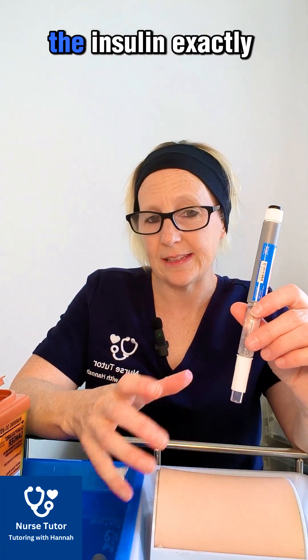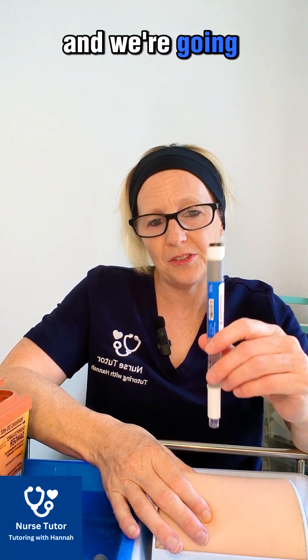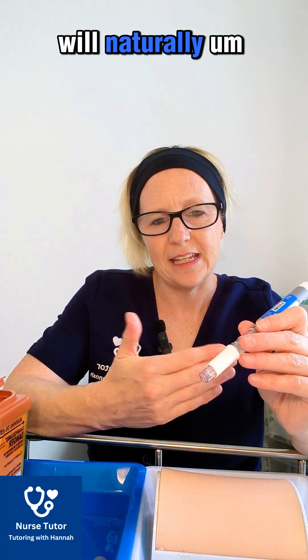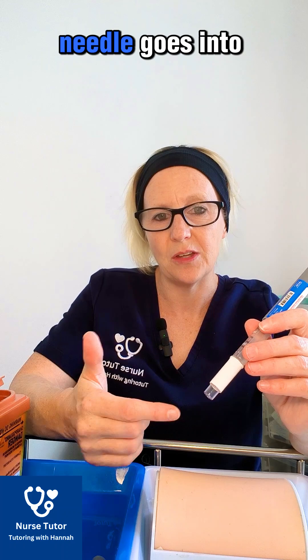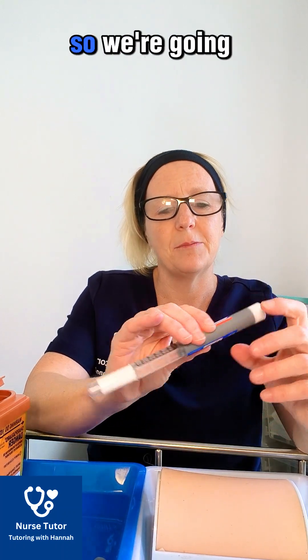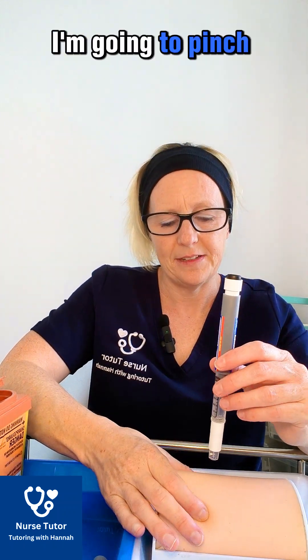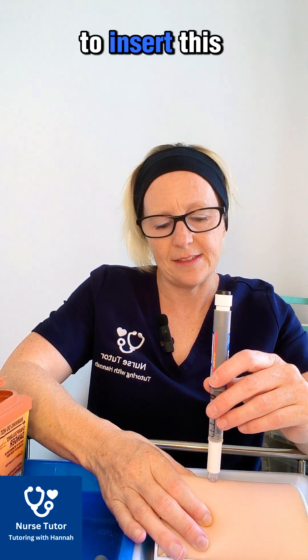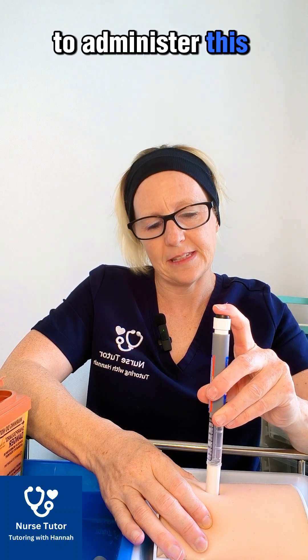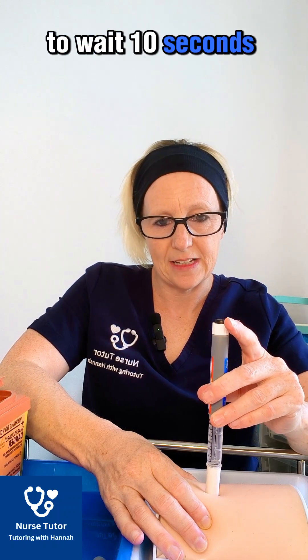We're going to administer the insulin using exactly the same technique. We pinch the skin and inject at 90 degrees. When you inject, the plastic cover will naturally retract so the needle goes into the patient. It can make a clicking noise, so don't worry about that. Set your prescribed dose — I'm just going to set six units here for practice — pinch the skin, insert at 90 degrees so the plastic part goes in, then administer the medication by pressing slowly and wait 10 seconds.